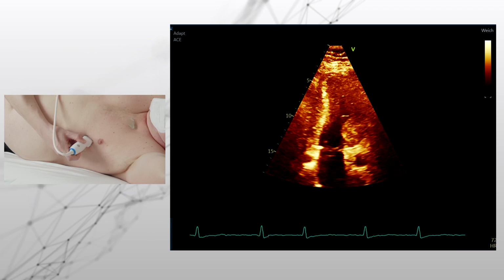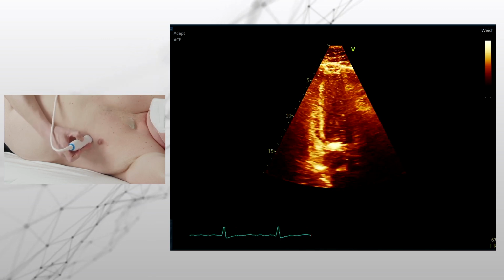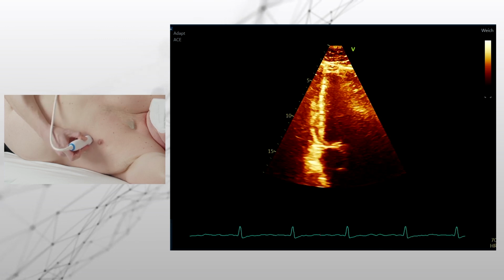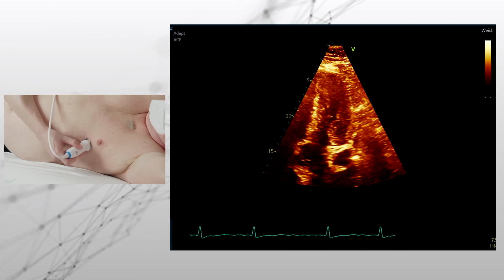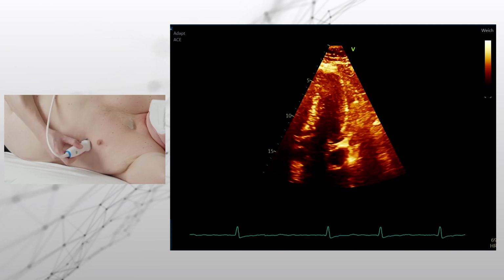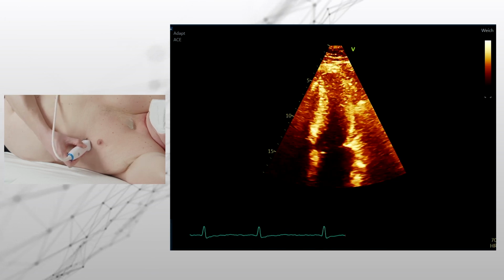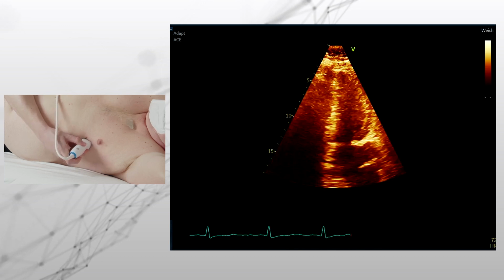So I also try to inhale and then hold my breath to see how long the patient actually can do it. And here you see the apical long axis view. It's relatively hard to see. Weiteratmen, perfect. And what we can also do is just use an apical 5-chamber view. And I use more than one view to see what's actually happening.